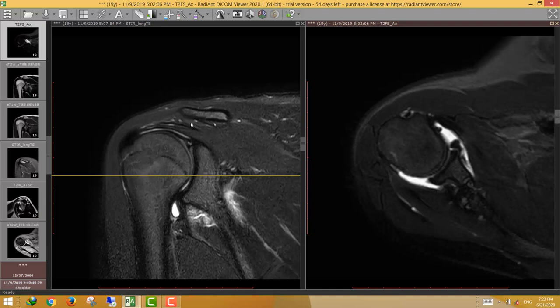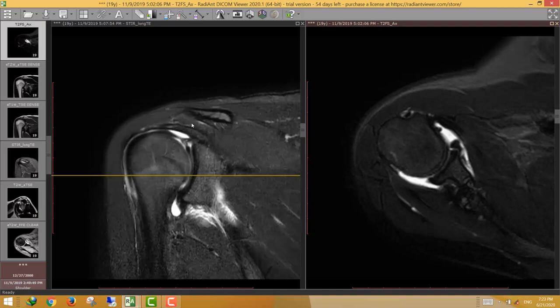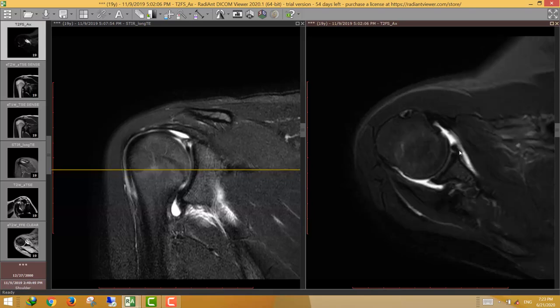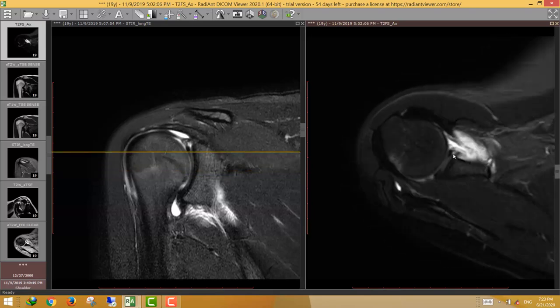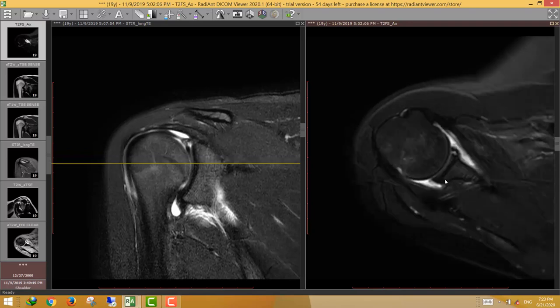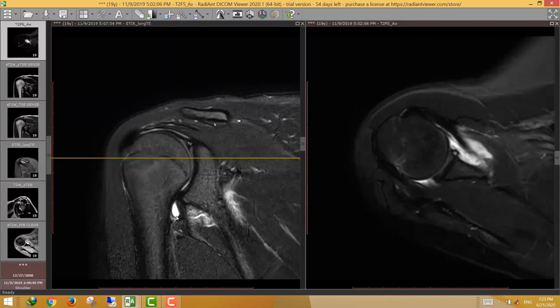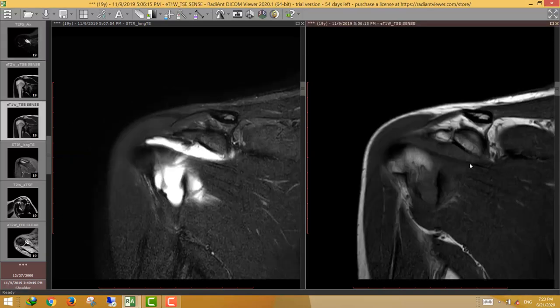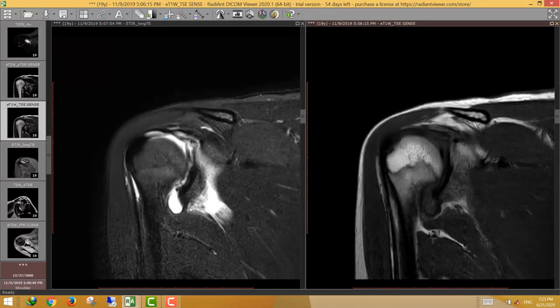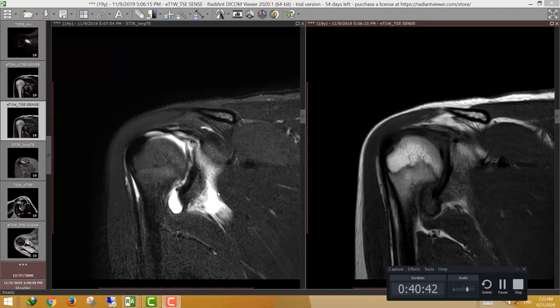An extended Bankart lesion is not the usual scenario but can occur — the tear in the anterior inferior labrum extends to involve the superior labrum and in certain cases even the posterior labrum or the whole labrum. So this patient has an extended Bankart lesion, Hill-Sachs injury, and the effusion is relatively high signal on T1, indicating hemorrhagic joint effusion. Thank you very much — hope we will meet soon, inshallah.